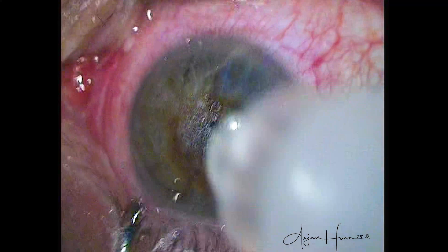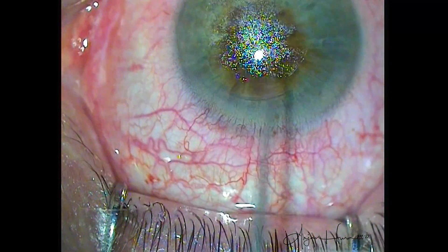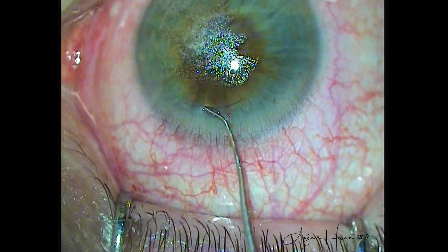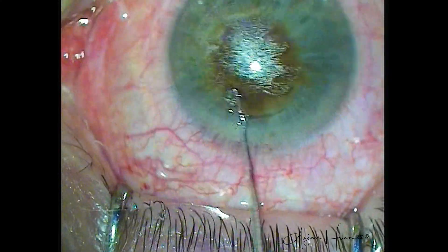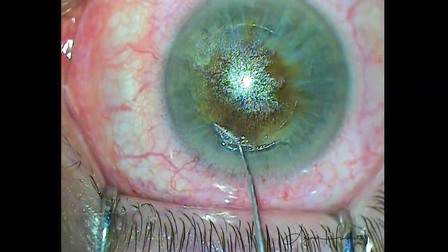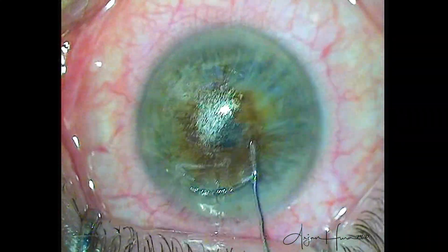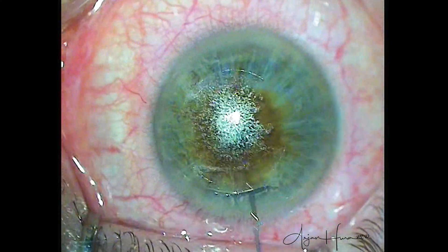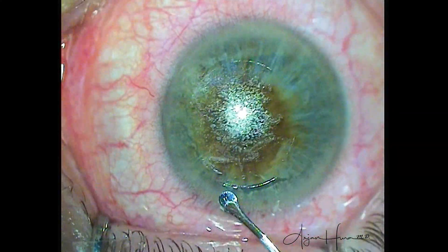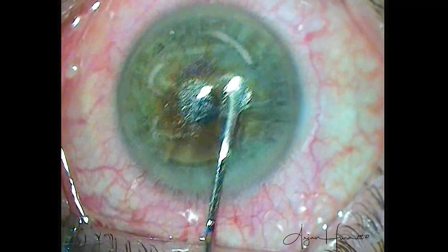Let's say this was LASIK. It would be easy to lift the flap and just irrigate out all of the red blood cells from underneath it — this can be done while the patient is still underneath the laser in the supine position, or it can be delicately done at the slit lamp microscope as well. Once the flap is smoothed into place with the edges properly aligned, as long as there's not a large gutter, it's pretty hard for blood to get underneath the flap unless some sort of trauma in the first few hours causes the flap to dislodge. The endothelial cell pump function of the cornea will immediately cause the LASIK flap and stroma to start to deturgese and suction it back into place.